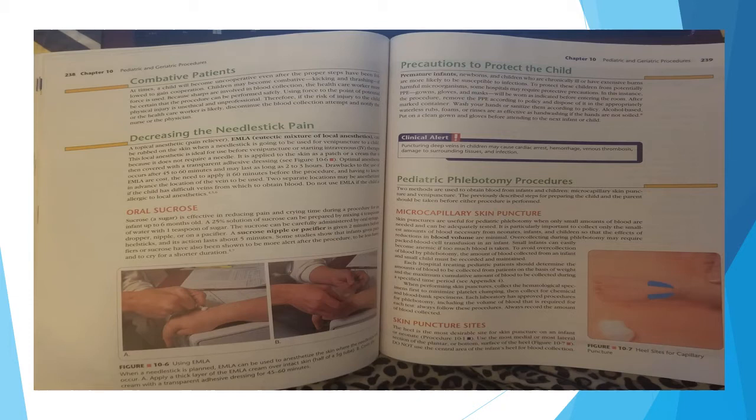Microcapillary skin puncture. Skin punctures are useful for pediatric phlebotomy when only small amounts of blood are needed and can be adequately tested. It is particularly important to collect only the smallest amounts of blood necessary from neonates, infants, and children so that the effects of reductions in blood volume are minimal. Over-collecting during phlebotomy may require packed blood cell transfusions in an infant. Small infants can easily become anemic if too much blood is taken.